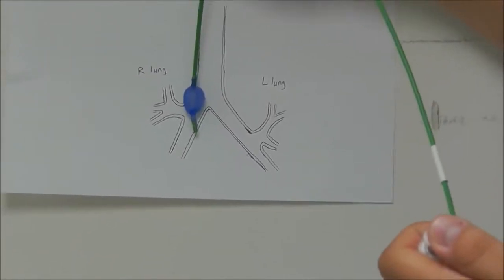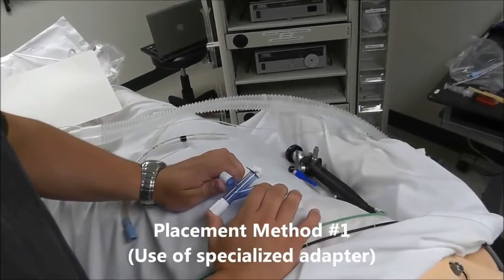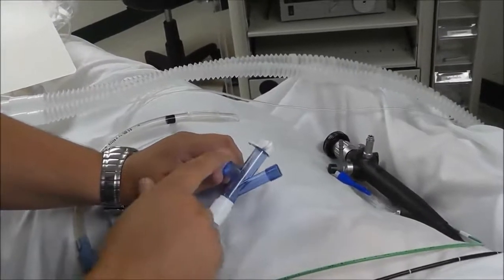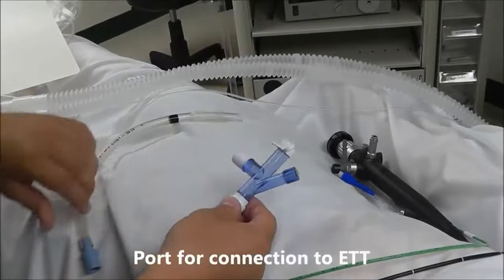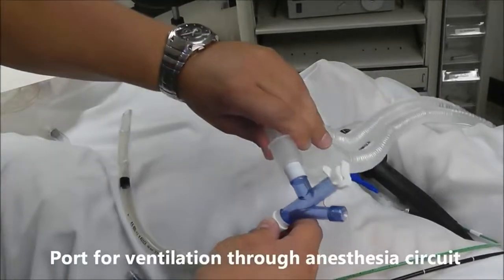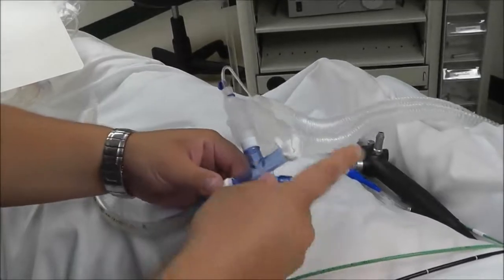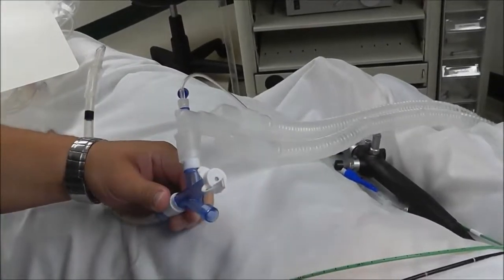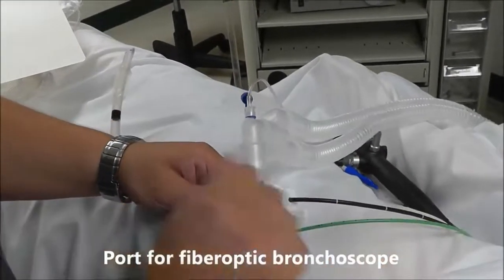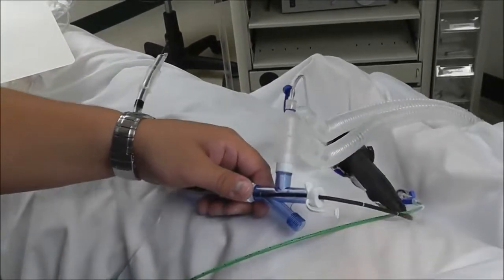Let's look at some of the other materials and setup and placement of the bronchial blocker. One method to placing this bronchial blocker utilizes a special adapter which comes with the bronchial blocker itself. As you notice, it has 4 ports. The bottom port here connects to your endotracheal tube. This side port allows for connection of your circuit to allow for ventilation throughout the blocker placement. This top one with this rubber gasket allows for placement of your fiber optic scope down the endotracheal tube. The gasket seals, that way you can still provide positive pressure ventilation throughout the blocker placement.